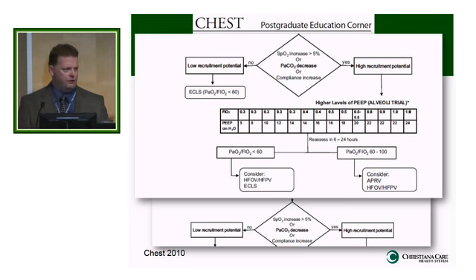I know someone asked a question, how do you get everyone on board? This is just one that was published in Chest in 2010. Not that it's the best one out there, but it is one. Dean Hess had a hand in writing this, as well as Curtis Sessler from, I think, the Richmond, Virginia area. And I think it's very logical in that they say you approach patients with ARDS or ALI with ARDSNet guidelines. That's pretty much a standard. I don't know that anyone would say you don't do that.